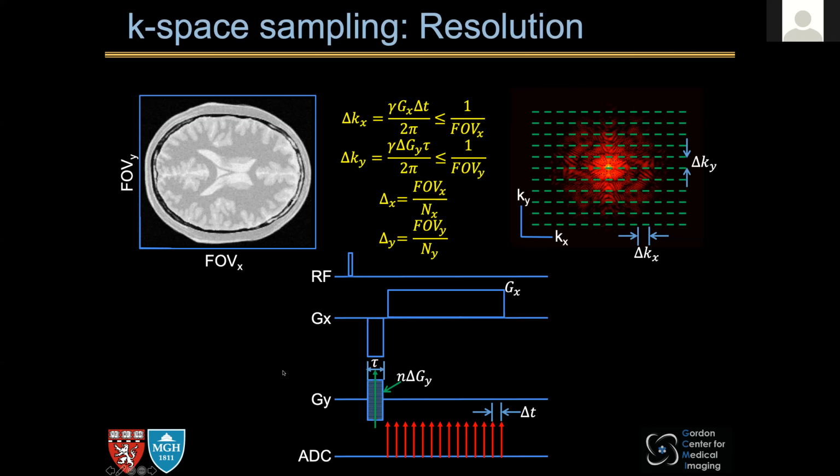But very often that is not enough. This imaging experiment usually tends to last very long. So a very hot topic in current MR research is how to accelerate the imaging speed. Let's see what we can do to acquire data more efficiently.